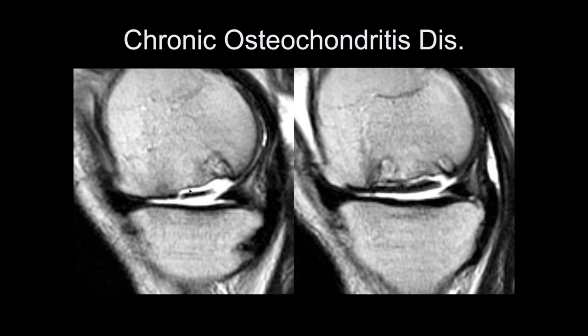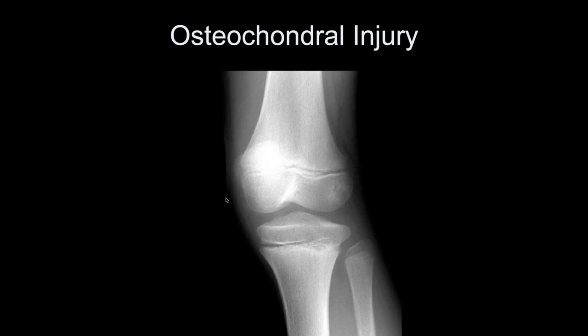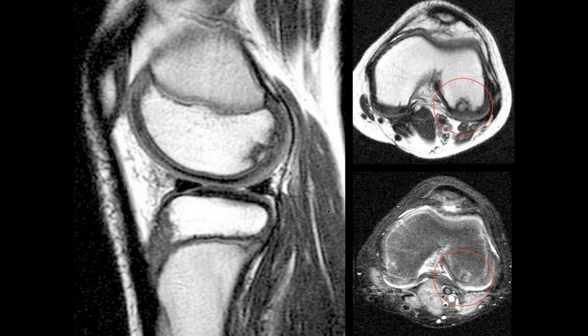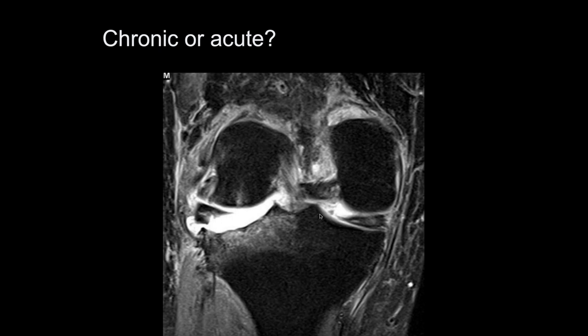In these cases, people are now trying to treat large osteochondral defects with graft placement and replacements, or unicompartmental knee replacement depending on age. Looking at another case — the lateral femoral condyle shows irregularity, lucency, and sclerosis around the borders. On MRI, there's an osteochondral injury at the posterior lateral femoral condyle with some fissuring, but the cartilage looks intact. No fluid interdigitating, no cystic change, not much bone marrow edema. This appears to be an acute injury with intact overlying cartilage.